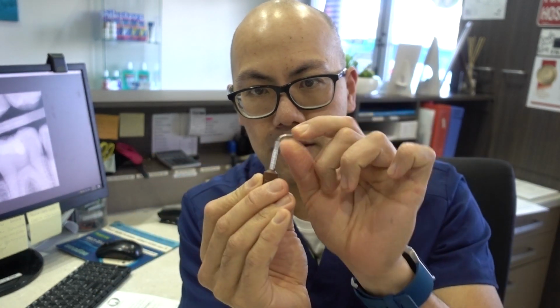It gets mixed in a mixer. Dispensing is really easy. It goes through one of these little mixing tips, which you can actually physically bend. You place the tip into the deepest portion of your cavity and flow it out, kind of like a concrete mixer, and then it takes a good 90 seconds to set. Once it's set, it is rock hard. You also have the ability to cure it with a light cure if you really want to.